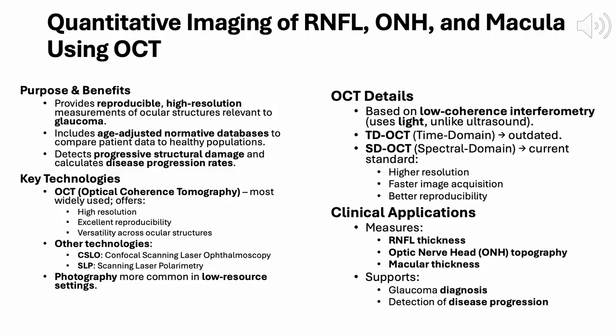But OCT remains the most widely adopted, especially in well-resourced settings. In contrast, photography is still commonly used in more resource-limited environments. Clinically, OCT helps us measure RNFL thickness, optic nerve head topography, and macular thickness. These parameters are crucial for diagnosing glaucoma and detecting its progression over time.